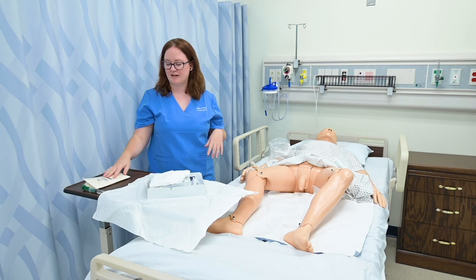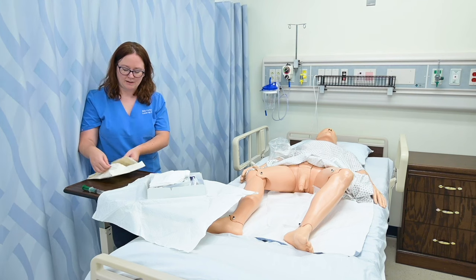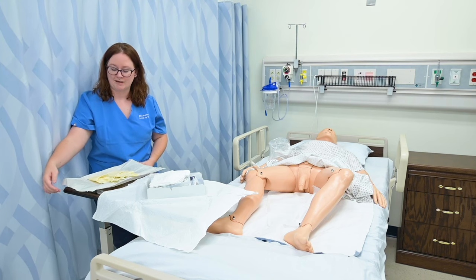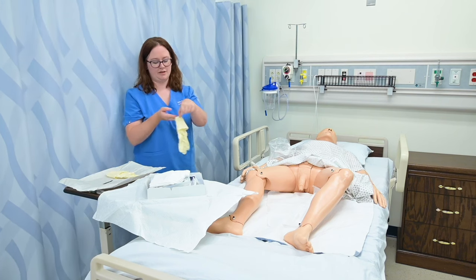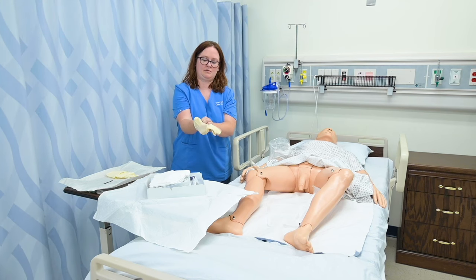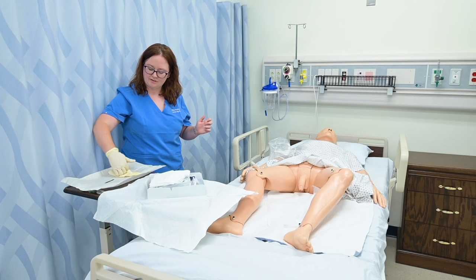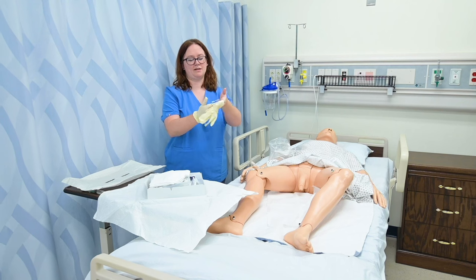I'm going to go ahead and put on my sterile gloves. Most kits come with sterile gloves, but I just prefer to grab my size because I know my size and it's more comfortable for me. I'm going to do my sterile gloves over here on the edge of the table so that I'm not leaning back over my sterile field. I'm going to grab my first glove, putting it on my dominant hand, and then with my dominant hand grab my second glove and pull that onto my non-dominant hand.